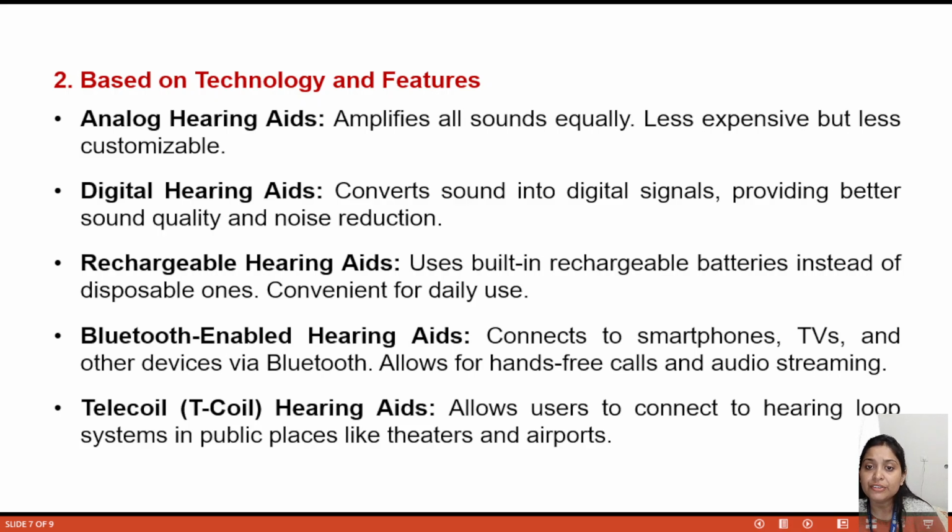Then rechargeable hearing aids use a built-in rechargeable battery, so we can use them many times.